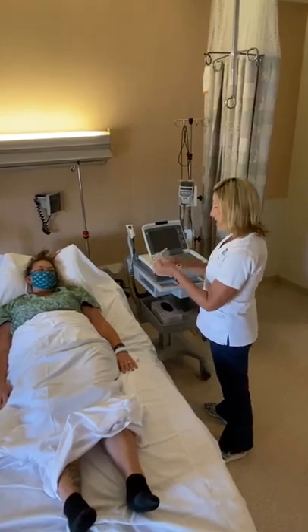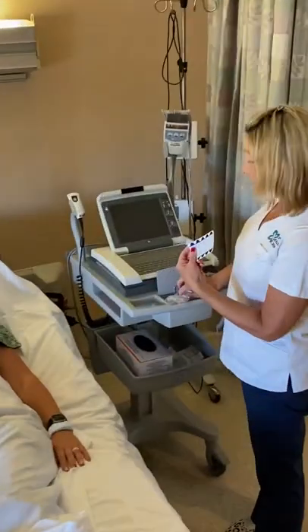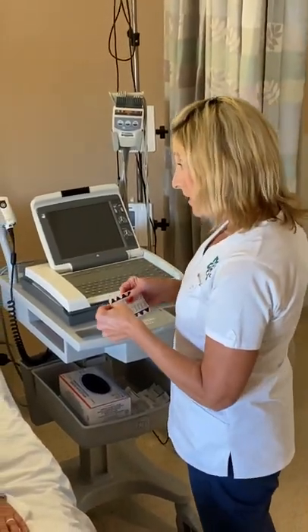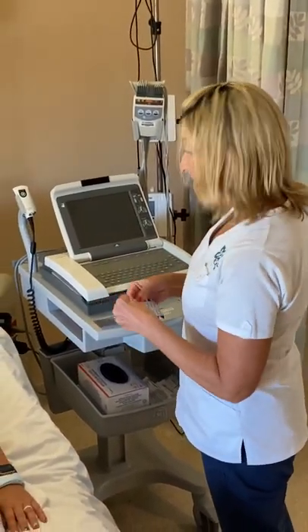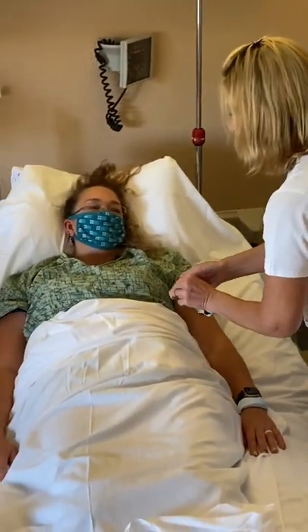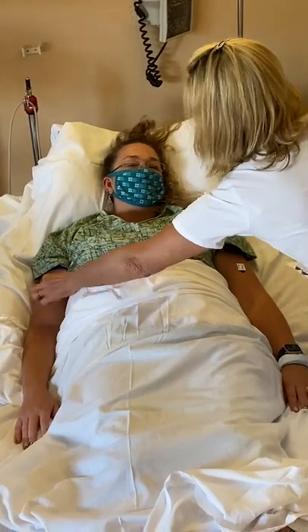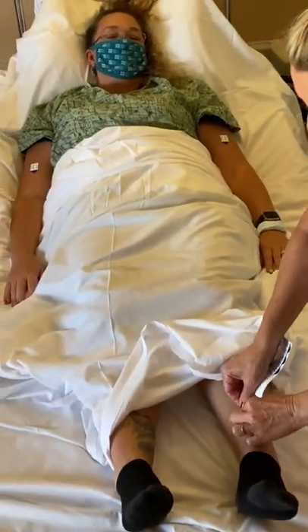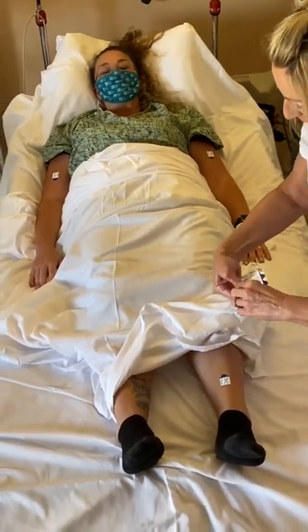So the EKG leads are kept in this front pocket, and we only open one package at a time so that they don't get dried out. Oh, nice. Kind of a good idea, right? All right, so the two for your arms, pretty much anywhere on your arms is okay. The two for your legs, again, pretty much anywhere is okay.